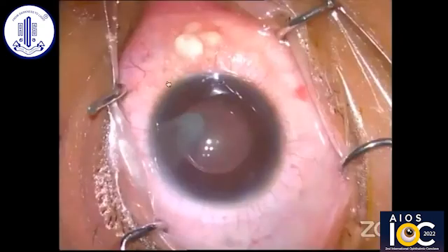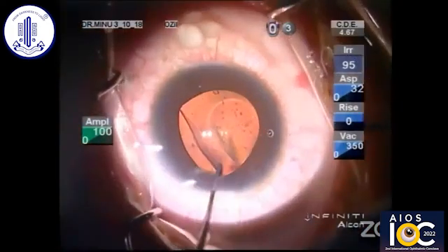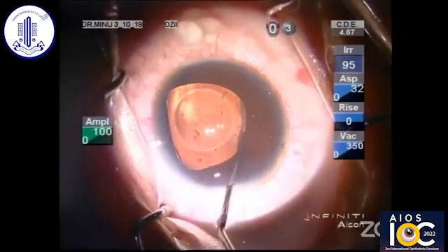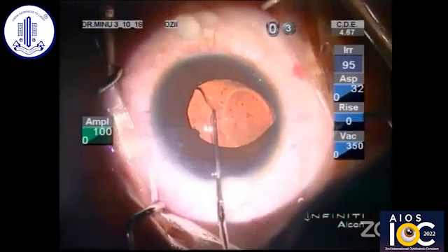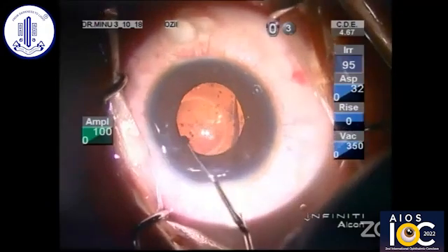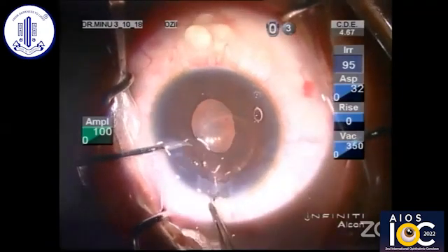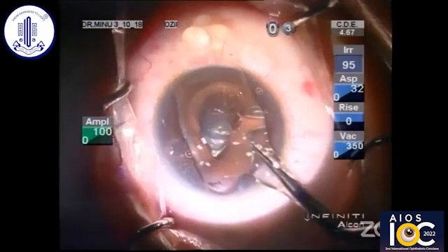The last video covers an ICL case. This patient has undergone retinal surgery after an ICL and the silicone oil is emulsified. We are doing an IOL implantation plus silicone oil removal. It is not very easy if the pupil is not well dilated, but the ICL is very fragile, thin, and easily maneuverable. We should not break the anterior capsule while doing this because we have to do a capsulorhexis. The ICL has holes on the sides — you can hold those and dial it out with retentive viscoelastics. One haptic is brought out, then the other. You do not need to bisect it. Hold one end of the haptic and through a 2.8 mm incision it is very easy to pull out gently — it folds on itself and comes out. Then we can proceed with the procedure. Thank you very much.